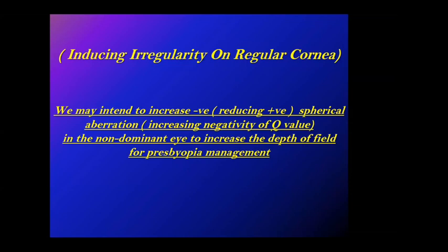Yes, by topo, you can change the shape. But if you change the shape, you will need more extra energy. But if you do it with wavefront, it's minimal microns. Yes, okay, I agree with you. Topo guided treatment is more aggressive than ocular wavefront guided treatment. I agree with you. Yes.